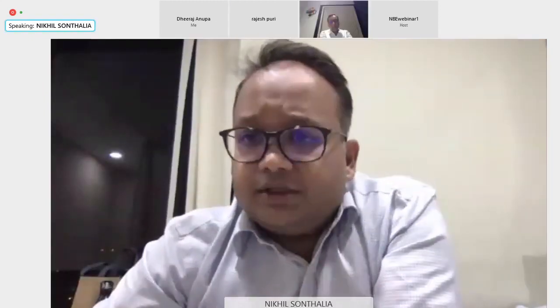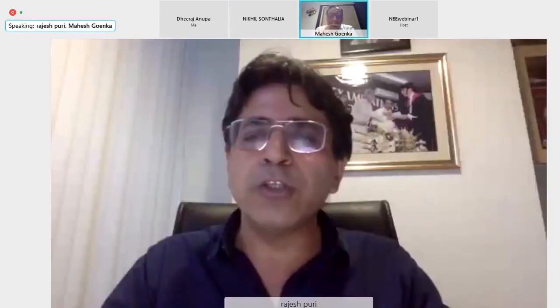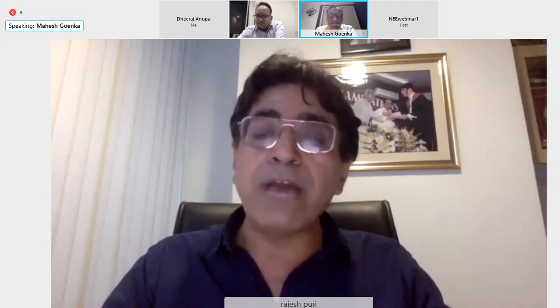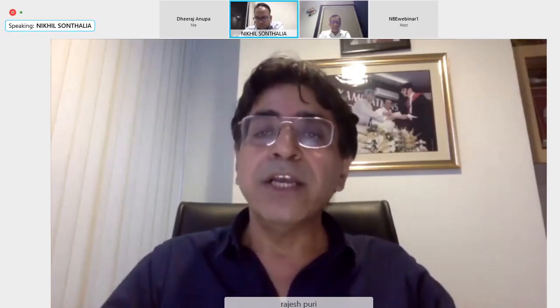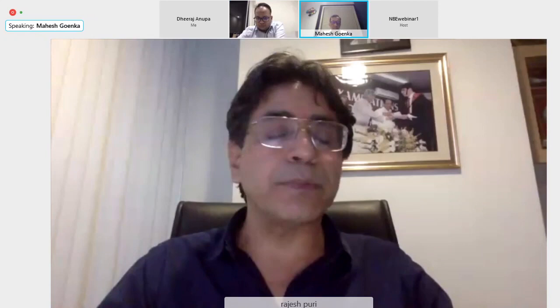The question is, in case of Crohn's disease, perirectal and sigmoid abscesses, can they be drained? What are the chances of fistula if you drain EUS-guided in this? Again, a very good question, and a very good paper by me as well as Shyam Varadarajulu. We have done diverticular abscesses, not Crohn's abscesses. For Crohn's abscesses, the results are poor. In patients who have post-operative collections, EUS-guided pelvic drainage has very good results and is very successful. But Crohn's disease abscesses are generally small, and the risk of complications is higher. So diverticular and Crohn's abscesses should be avoided with EUS. It is better to treat with antibiotics or by surgical diversion colostomy.